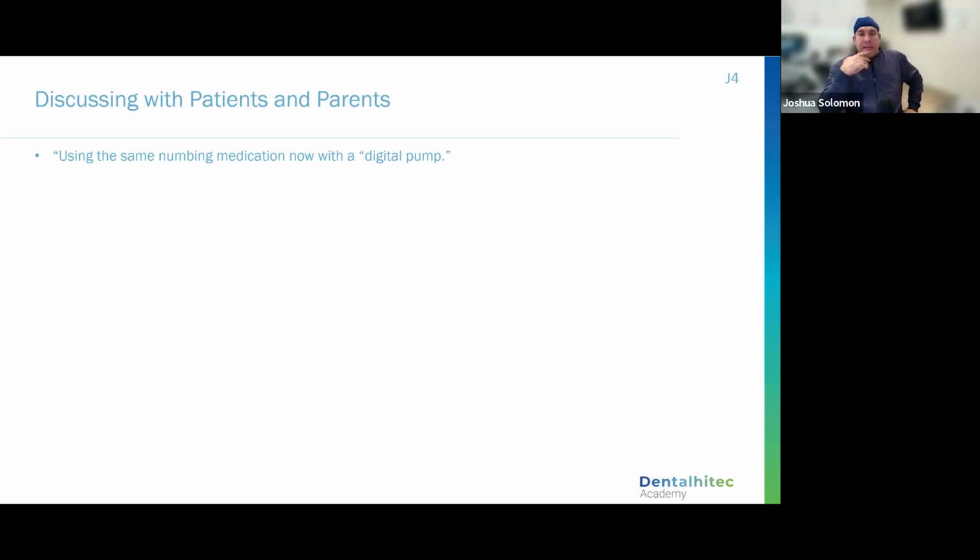I added this tonight, and I think this is important. Once we first get our units, many people are very excited, right? Oh, I've got this new thing and I want to talk about it. The truth of the matter is, parents don't necessarily like things that are new. They don't want to feel like you've got some new device that's not very tested and not used on the market.